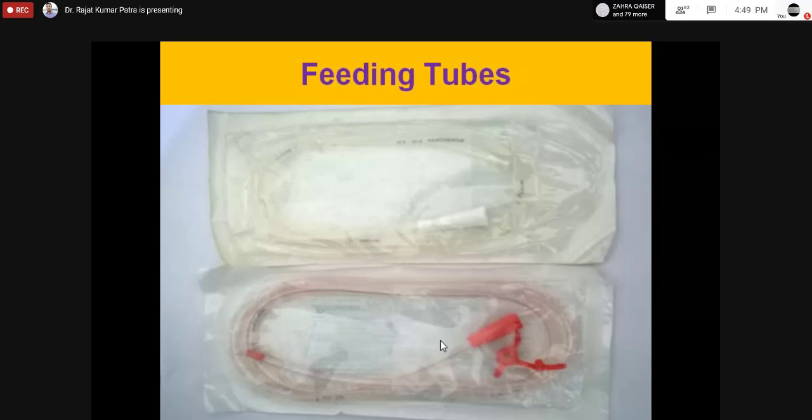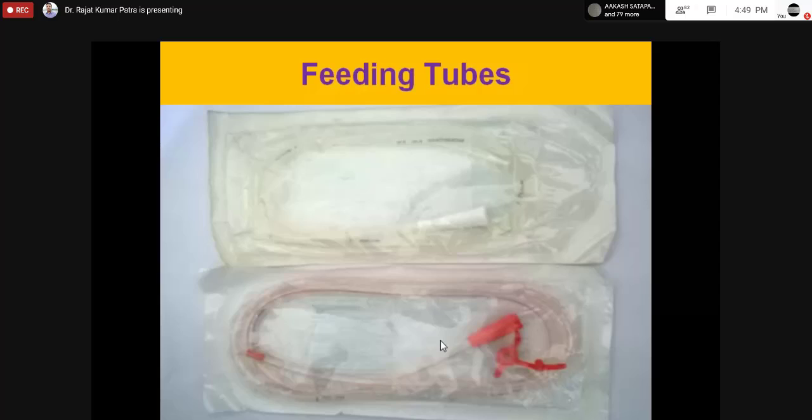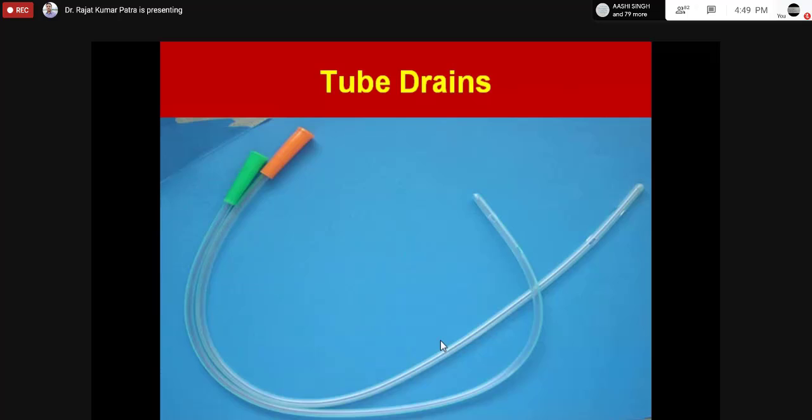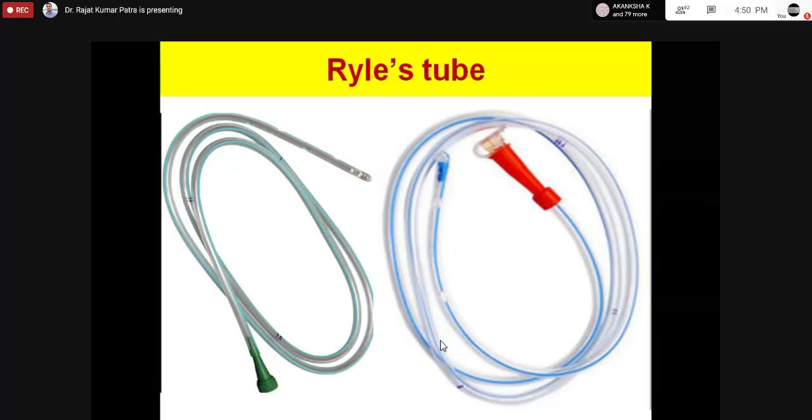Feeding tube, nasogastric feeding, okay, these are feeding tubes. This is a suction catheter. Remember all this. First is Foley's catheter, you will definitely identify. This is a tube drain, or in some places you may get a rubber drain also. Then this is the Ryle's tube, okay. This is a feeding tube. There are different colors, okay.